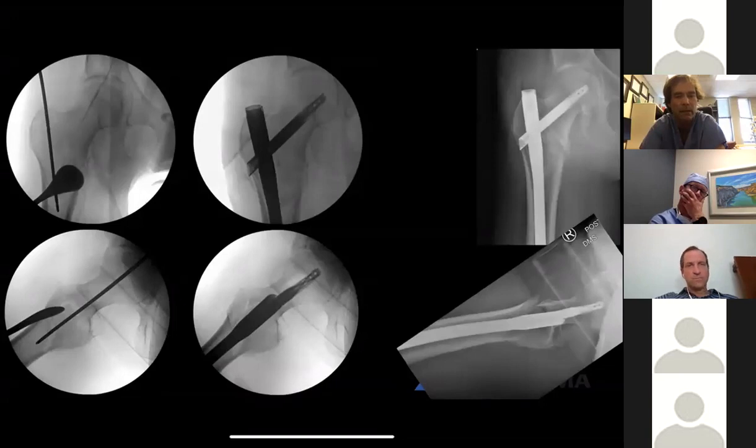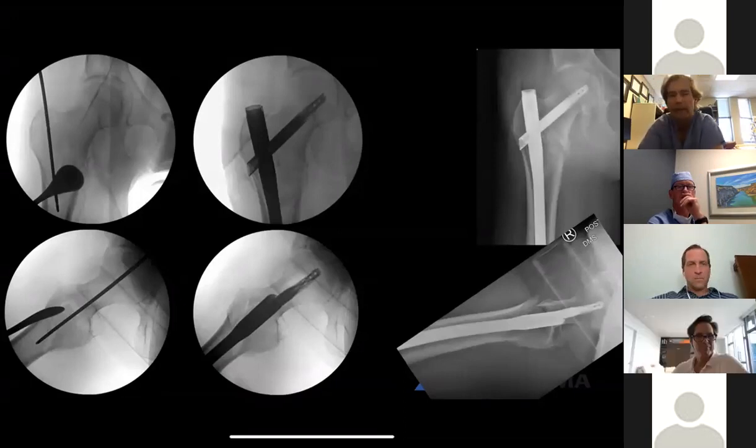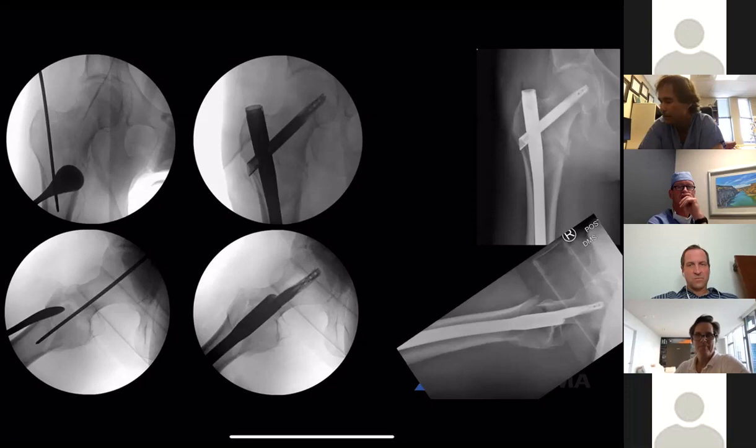When it doesn't, I typically try something like this. So I'm looking at the under-rotated lateral. If I see an anterior gap or asymmetry, then I try either elevation of the foot or internal rotation of the distal segment. If that doesn't work, then I'm looking at some reduction maneuver like this. Interestingly, you'll see that the lateral that we got postoperatively was not consistent with the one that we got intraoperatively, which once again shows sometimes you think you got it right and you didn't.